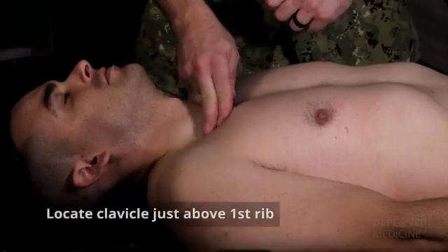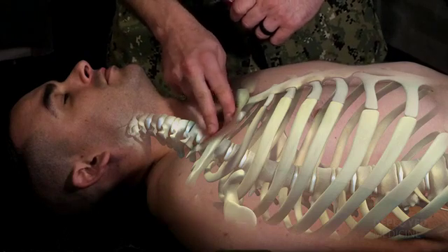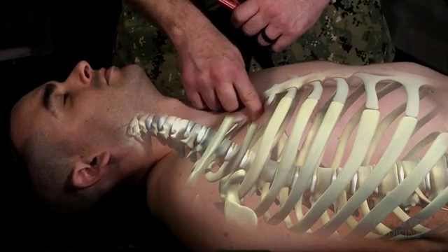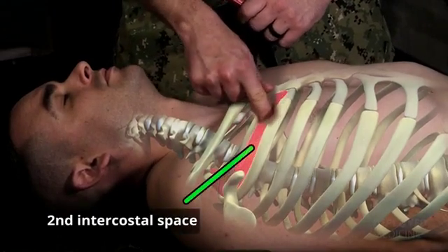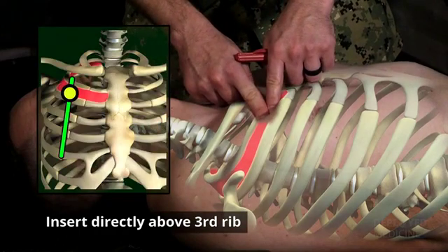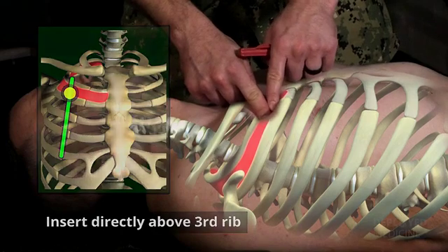I want to locate my patient's clavicle, which is also right above the first rib. Underneath that is the first intercostal space. Moving down, I find the patient's second rib. Underneath that is the second intercostal space. I'm going to insert my needle catheter here, directly above the third rib, so that I don't hit any arteries or veins along the bottom of that second rib.